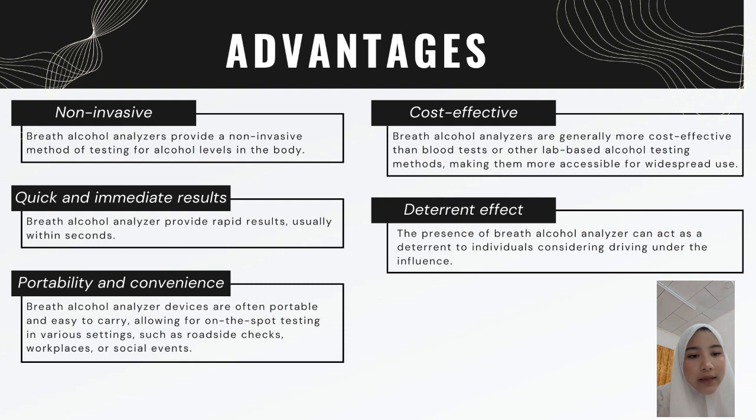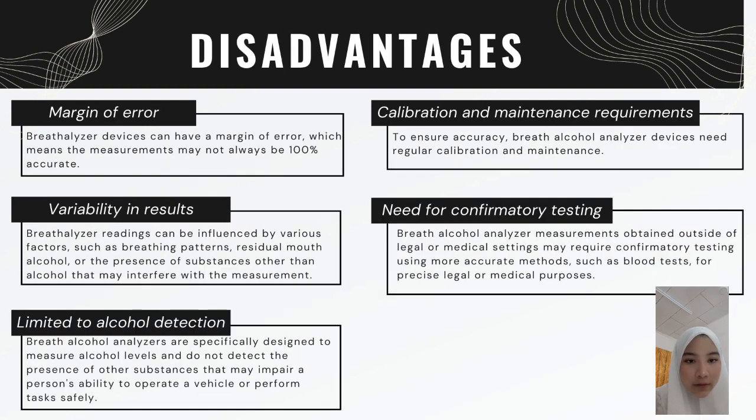Breath alcohol analyzers are generally more cost-effective than blood tests or other lab-based alcohol testing methods, making them more accessible for widespread use. The last one is deterrent effect. The presence of breath alcohol analyzer can act as a deterrent to individuals considering driving under the influence.